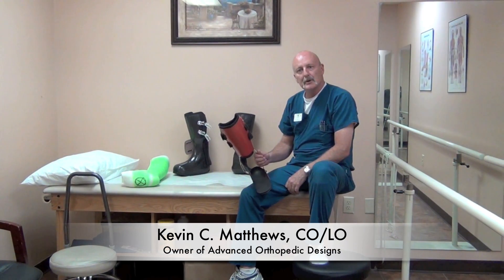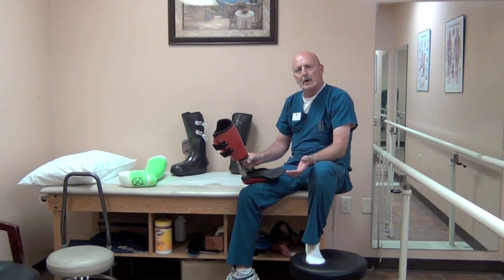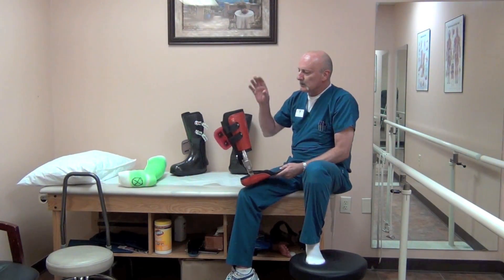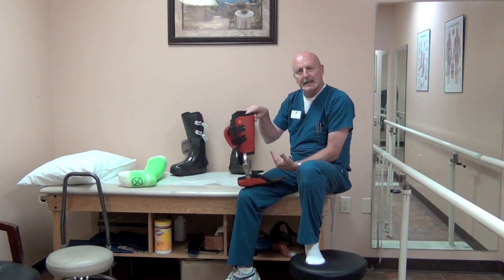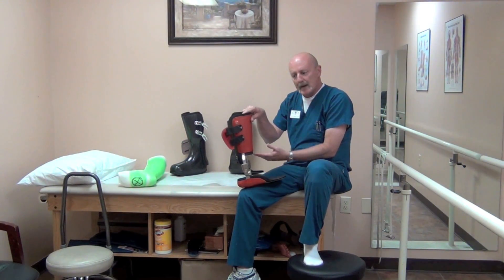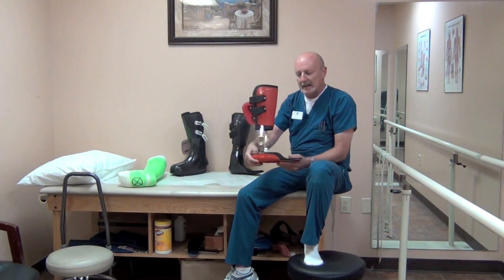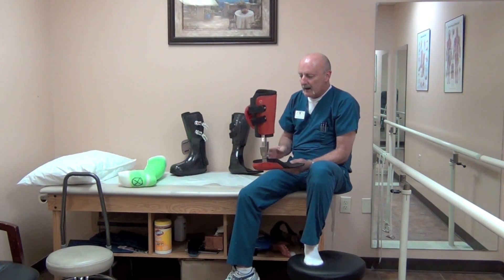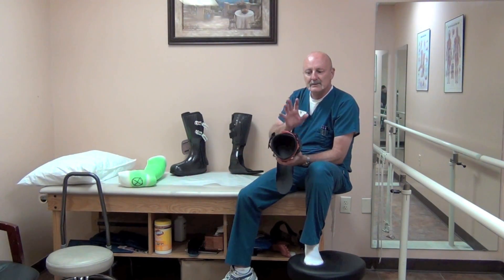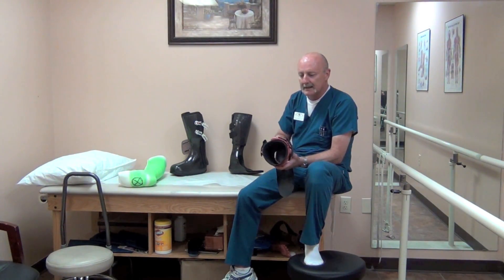Hi, my name is Kevin Matthews. I'm the owner of Advanced Orthopedic Designs, and I would like to introduce you to our new line of AFOs called Load Shifters. What these AFOs do is they effectively remove up to 100% of the weight carried through the heel and the ankle by transferring the load to soft tissue of the lower leg.